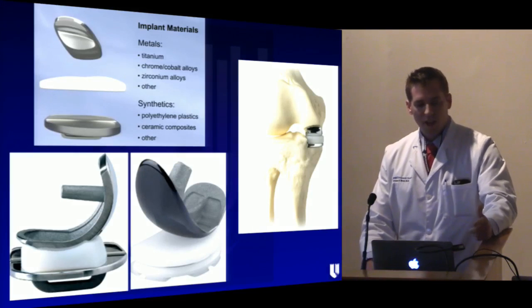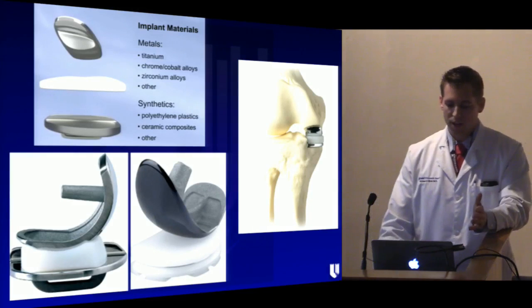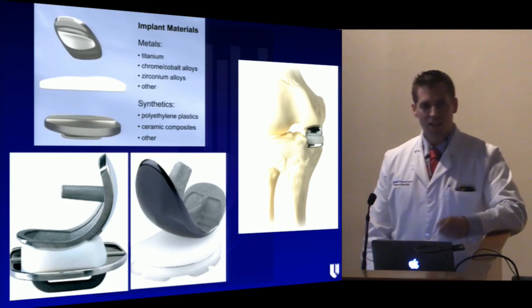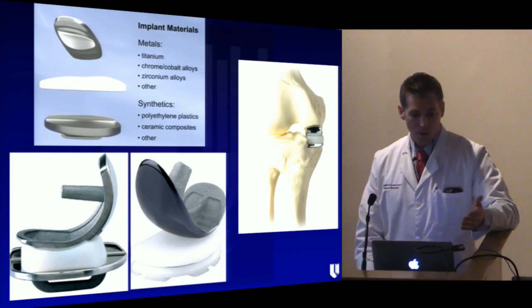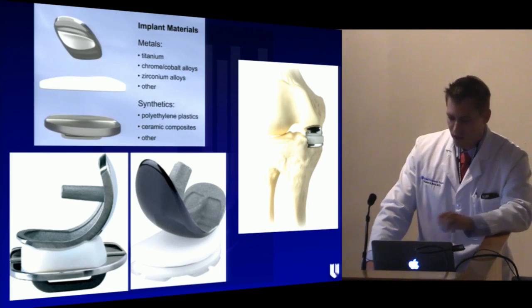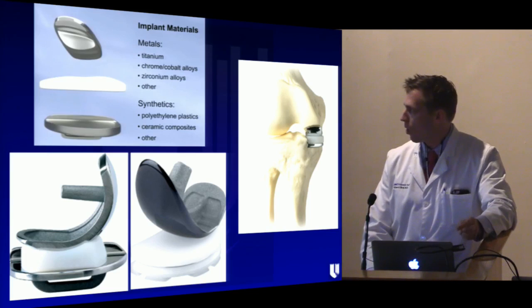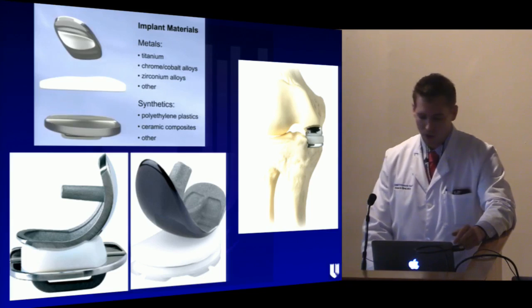So while the notion of unicompartmental arthroplasty has been around for almost 60 years, the implant itself has come quite a long way. At its conception in 1957, Dr. McKeever actually had a hemiarthroplasty solution with an all-metal tibia. However, now today's surgeon, you can see from our pictures here, has a choice of both mobile or fixed bearing devices with cemented femur and tibial components.